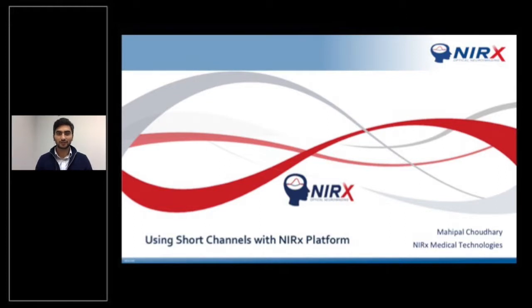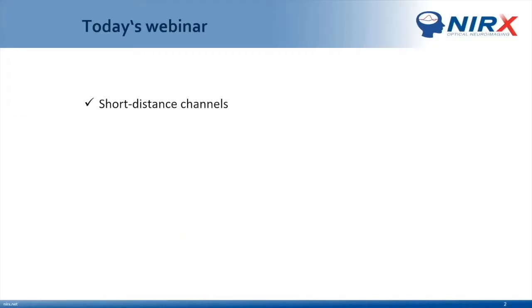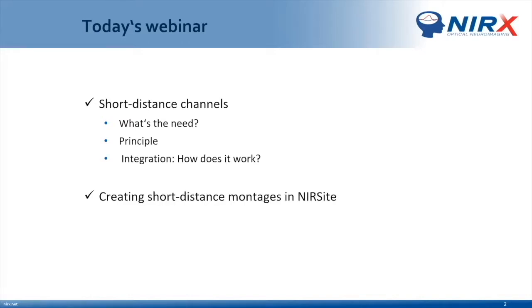My name is Mahipal, and welcome to this webinar on setting up short distance measurements with NIRx devices. So let's take a quick look at the topics first. Start with some basics, and we'll briefly look into why we should use short channels. We'll also look into the working principle behind short channels, and then we'll see how they are integrated with NIRx devices. As a first step towards using short channels, we'll take a look at creating montages with short distance detectors in our montage design software NIRSite.